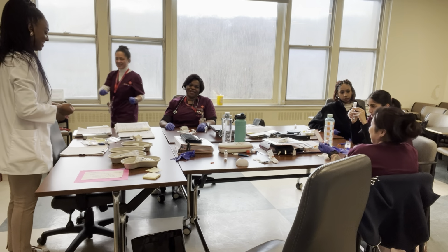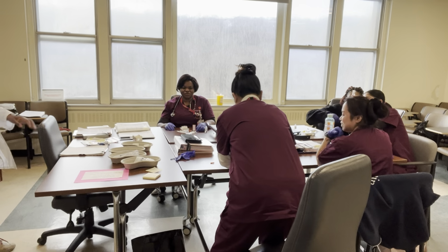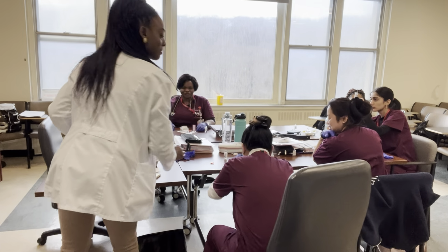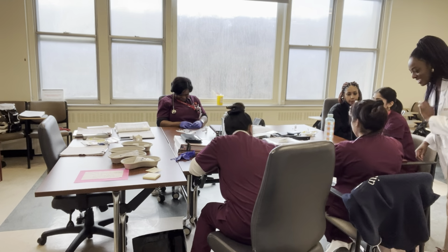Okay, and then I'm gonna go back to my patient. And then I'm gonna wipe it. Okay. I'm gonna close it. No, you don't want to wipe it. You're gonna put pressure on it. See if there's any bleeding. Okay, we're gonna practice this more. Okay, your turn, darling. Go ahead.